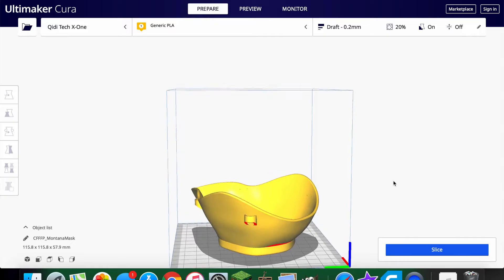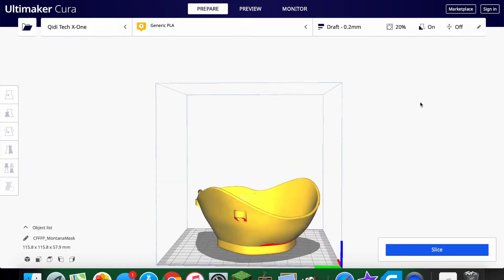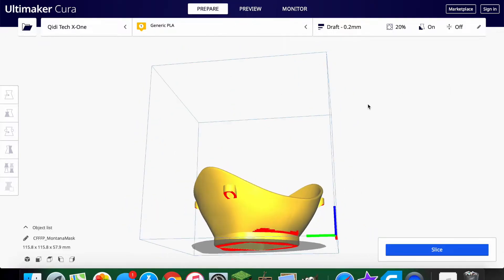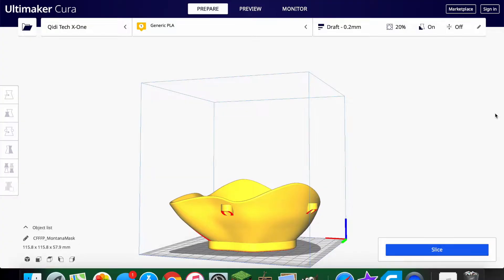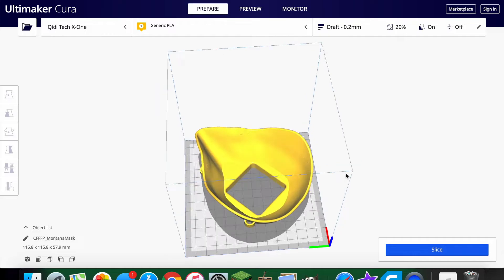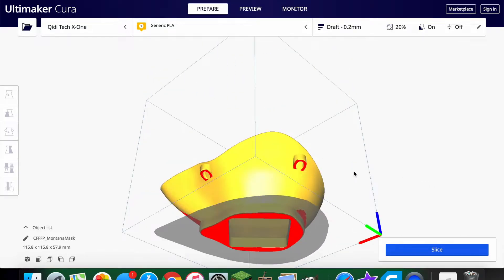Then we can come up here and mess with settings. For this particular file it's recommended not to print with supports, but I'm going to print with supports anyway. There's also a little filter piece you're supposed to put in the mask — I'm going to print that separately. After we get all that set up, we just click 'Slice,' put it on an SD card, and it's ready to go to the 3D printer.